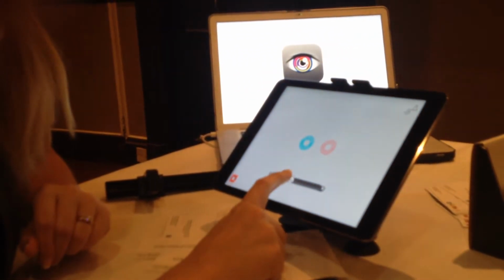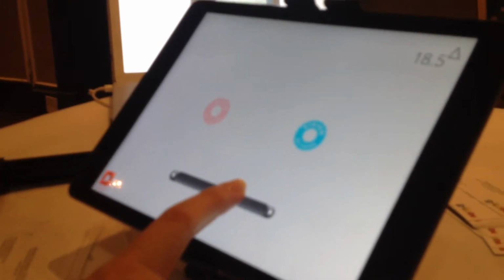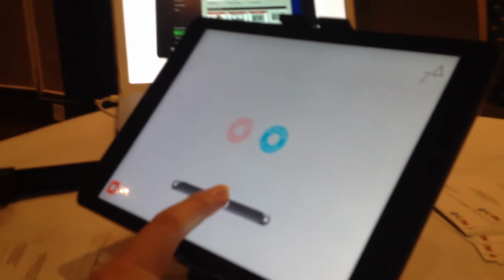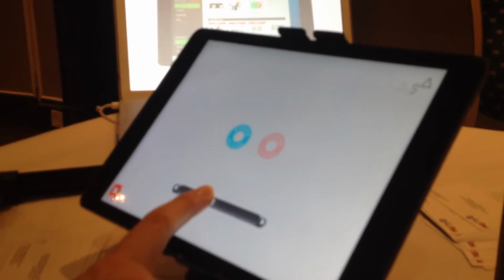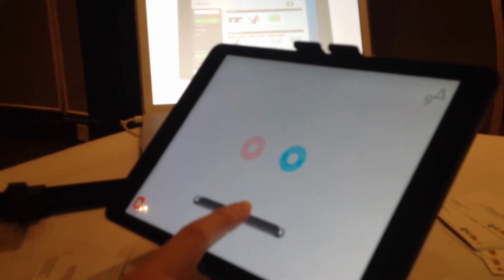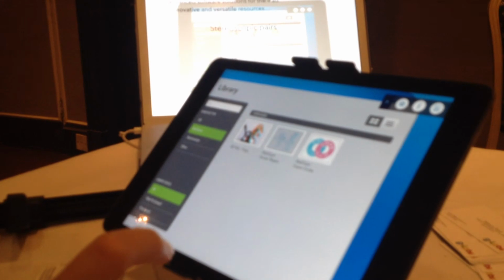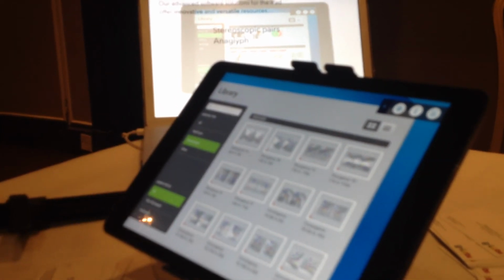We can actually build smooth fusional ranges. So many of these are currently available, but you're constantly working on new ones. Yes. And from what I've seen today, you can do oculomotor hand-eye, convergence activity, anti-suppression activity, and lots of 3D.